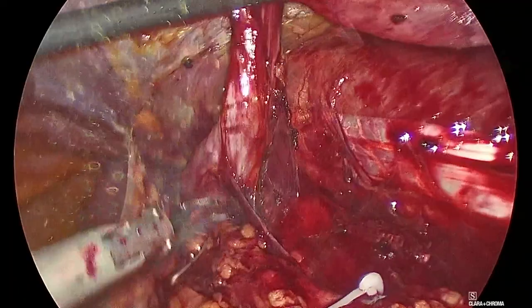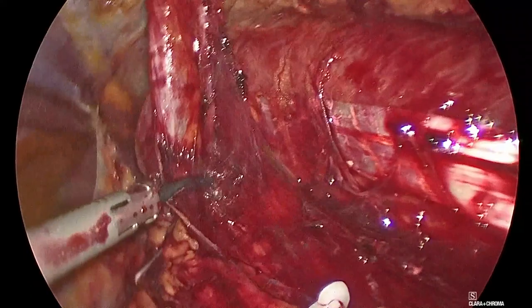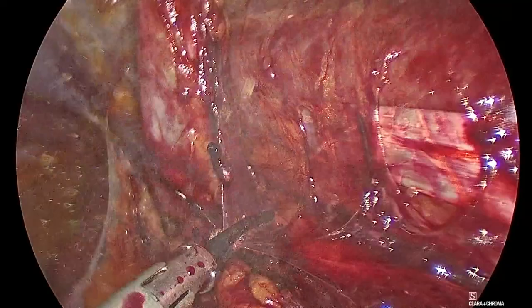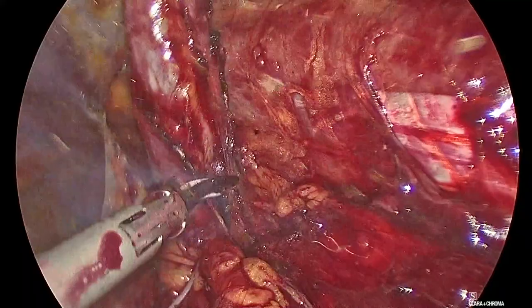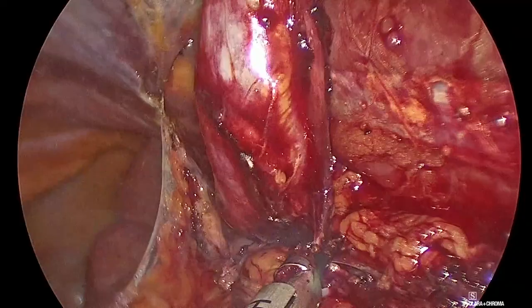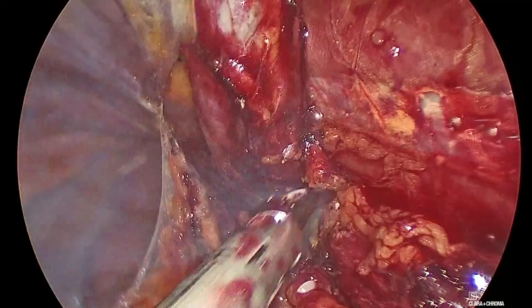But I think it's crucial, again, to everybody who does nephroureterectomy to have a good bladder cuff. I really don't like people that do laparoscopic extraction of the nephroureterectomy, because I have yet to see a very good bladder cuff in a laparoscopic excision. The majority of the times I see surgeons that go down there and they say, all right, she's 75, we just staple the ureter close to the bladder and who cares? And I think that's a huge mistake.